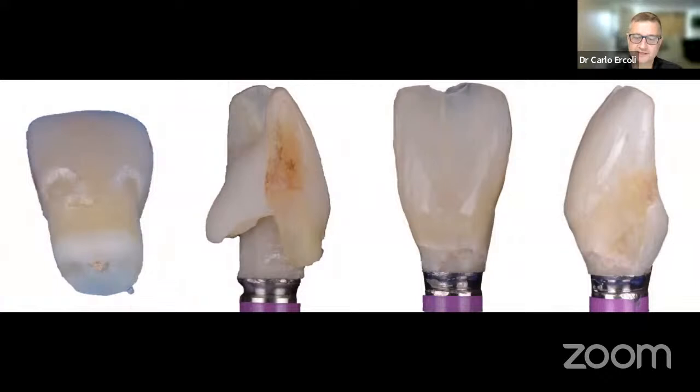Once the implant is placed, then it's a matter of fabricating that temporary restoration before the patient leaves the office that day. So you can either have a preformed crown that you adapt and shape to the implant with a temporary abutment. But in this situation, when I have the actual tooth, that's what I prefer to use. So what you see on the left is the tooth that has been cut off. And what we do is that we only keep the buccal component of the tooth. We make basically an enamel veneer. And then we place that in the patient's mouth, and with the help of some flowable composite, we immobilize it in place, as you can see on the second picture from the left.